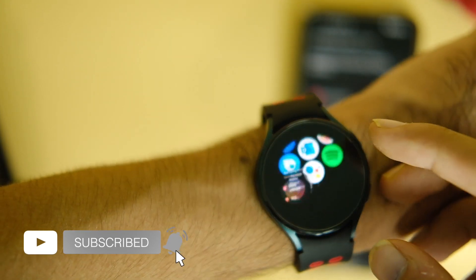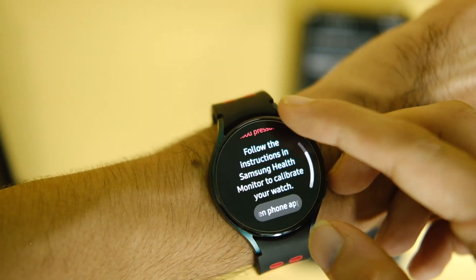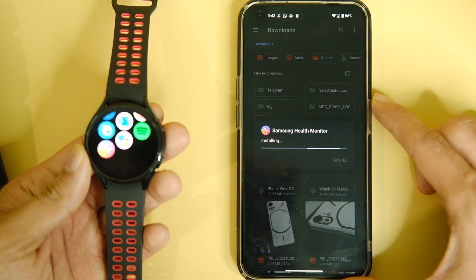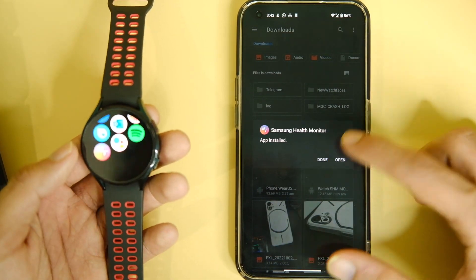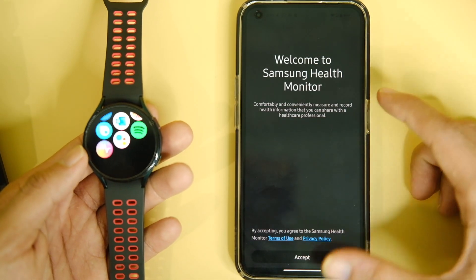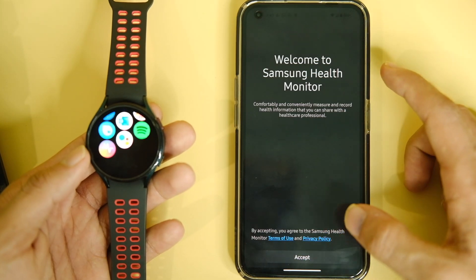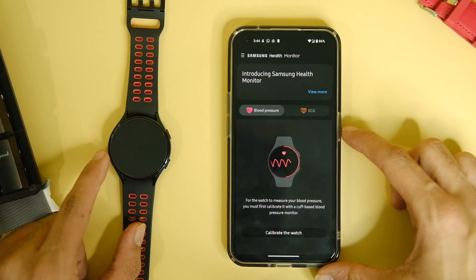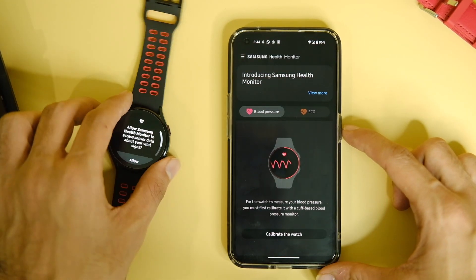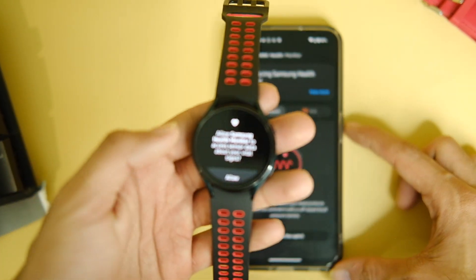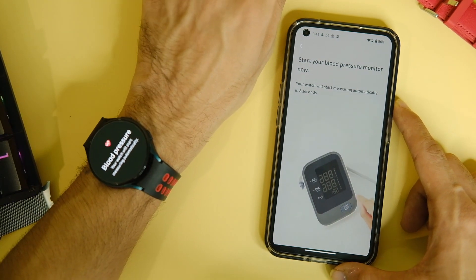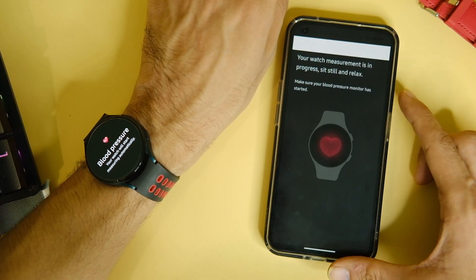Once this app is installed, open the file manager on your phone and install the Samsung Health Monitor app on your Android phone. After this, just set up the application, make your profile, fill all the details and you have now enabled ECG and BP monitoring on your Galaxy Watch 4. For blood pressure monitoring you will need a BP machine as well for calibration — only then it will be accurate.